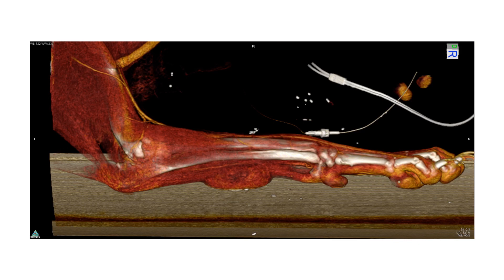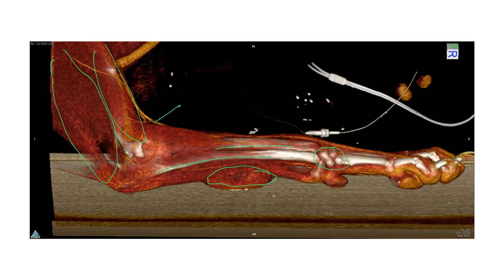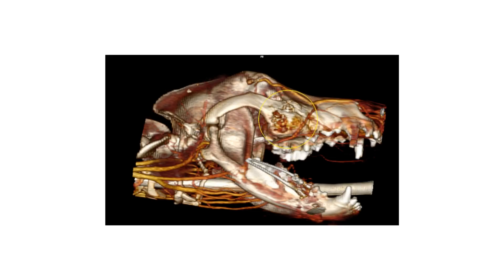Another nice thing that we can do with CT that we can't do with MRI is 3D volume rendering. The computer assigns soft tissue colors to different densities, and that allows us to see what looks almost like an anatomical specimen. For example, we've got a mass in the antebrachium here — we can see the ulna and the radius, the bones of the carpus, the triceps muscle, biceps muscle, and cephalic vein. This is really helpful for surgical planning, particularly for cancer. This is another 3D volume rendering of a patient with a maxillary mass at the zygomatic arch attachment to the maxilla — again, very useful for surgical planning and determining where large blood vessels are.